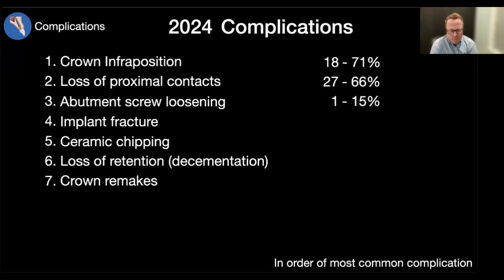And most commonly when we have abutment screw loosening, what causes the majority of it is there's some interference or occlusal contact that we don't see clinically that the patient's able to do somewhere outside of our office. And so it's normally an excursive interference. So we really need to check those lateral movements that the patient can make.